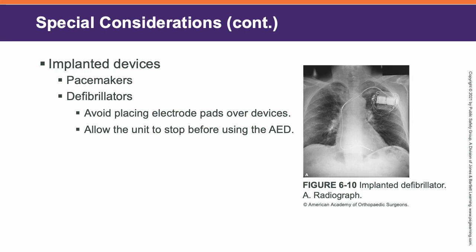Now, if you can see the defibrillator or the pacemaker, it's going to be bulging from the chest. Right here is typically where pacemakers are. Defibrillators are usually down here. You're going to want to avoid putting those pads directly on top of those devices.